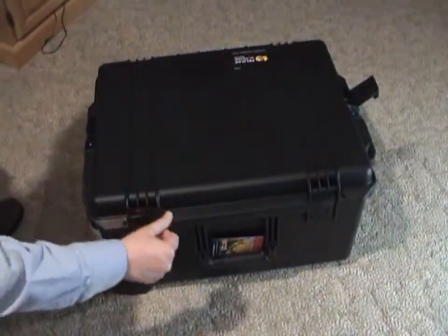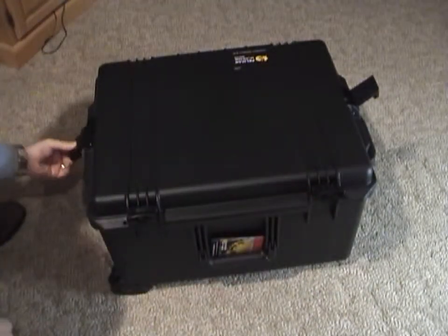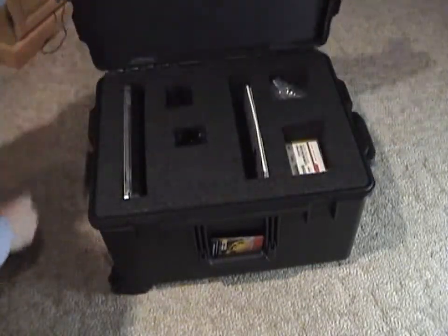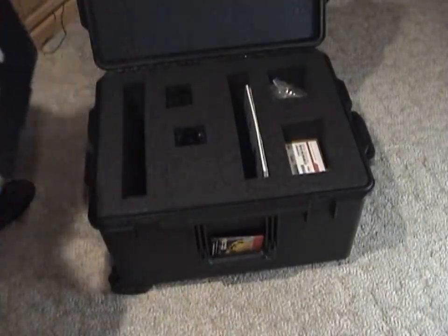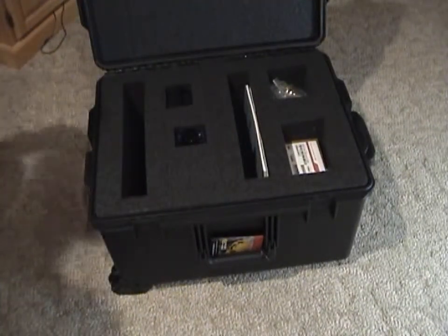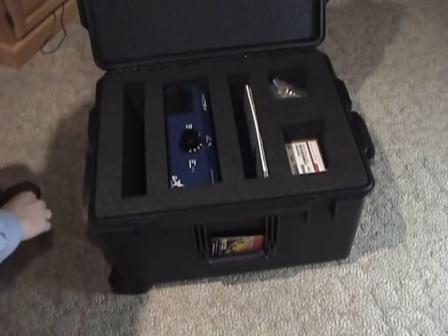Open the MicroStar case by pressing the release button, then lifting each of the four latches. Remove the laptop computer, the MicroStar reader, the hand scanner, and all associated cables.